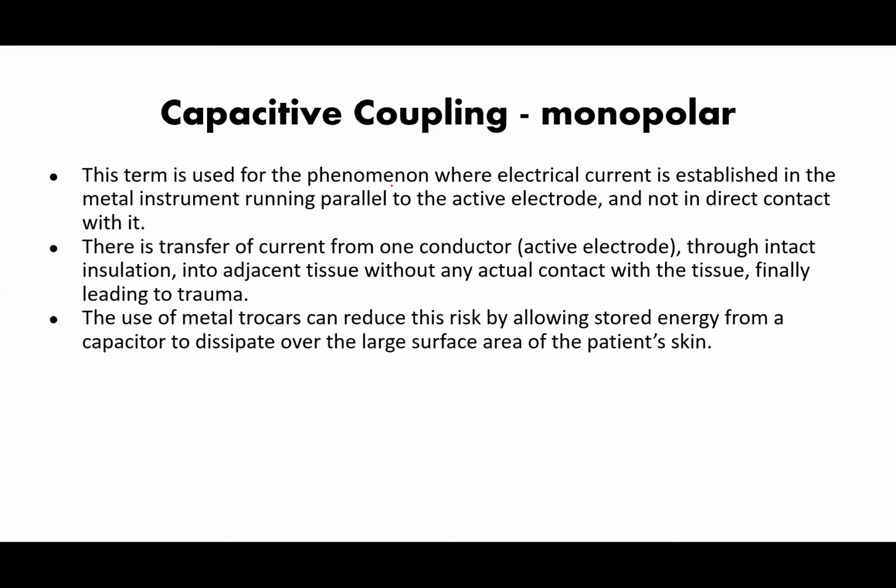There's also capacitive or capacitative coupling. This term is used for the phenomenon where electrical current is established in a metallic instrument running parallel to the active electrode. There's no direct contact, but by capacitative effect, current is transferred to the instrument that is running parallel to that electrified energy device.